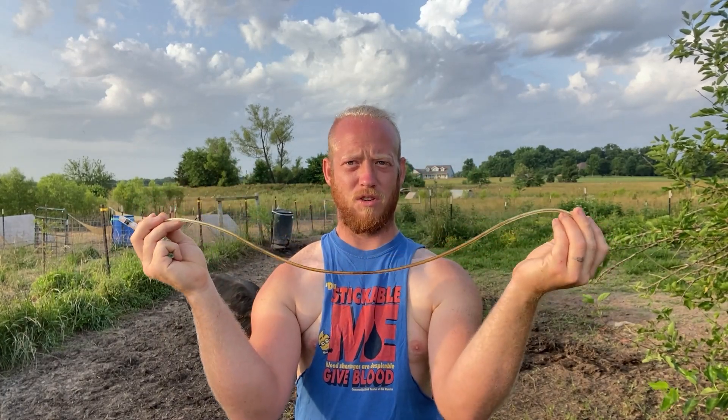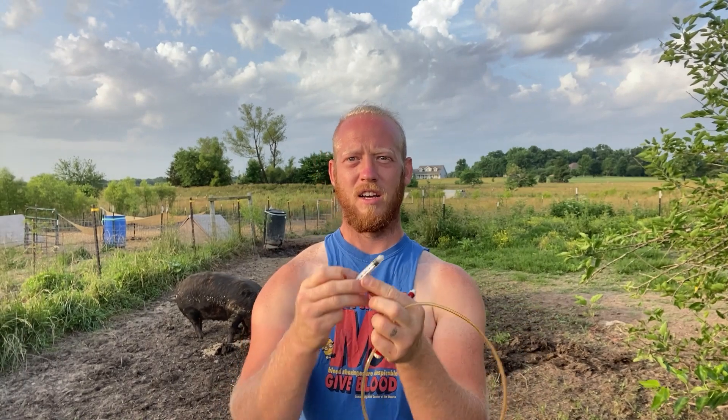This is my second time filming this so I gotta go a little faster because I want them to still be eating and distracted while we do this. This is a slap shot — super handy for giving injections because that hose allows you that movement as you're trying to vaccinate. Because they're gonna move around, and you want to get that full amount in there. This is a 2 mil syringe. When you buy your slap shot it'll only come as this. They're like 14 bucks — probably one of the best things I've ever bought for my farm.